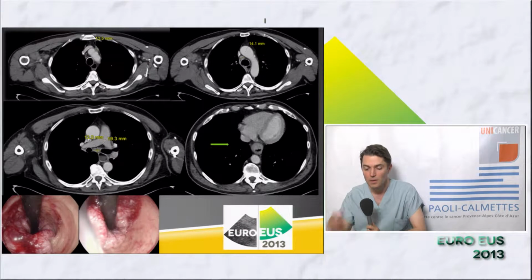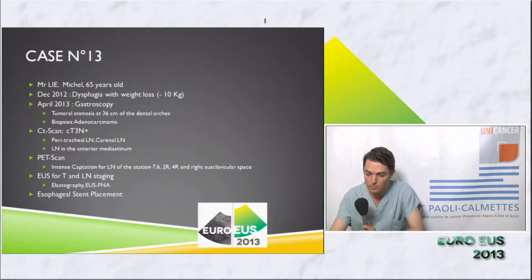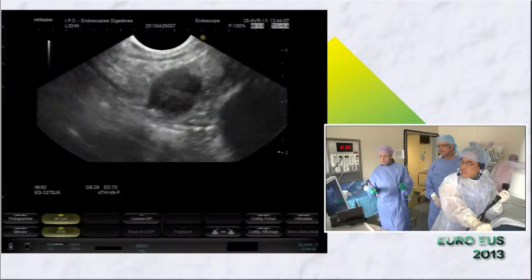Sorry. This is a CT scan with different lymph nodes in the anterior part of the mediastinum, peritracheal, subcarinal, and the lesion. And below, you can see the endoscopic view from a few days ago. We should remind the different areas explored by EUS. In EUS, we can assess only areas 2, 4, 7, and 8.